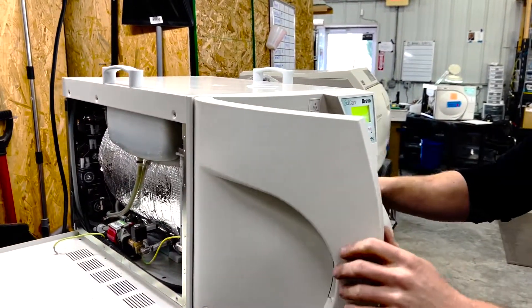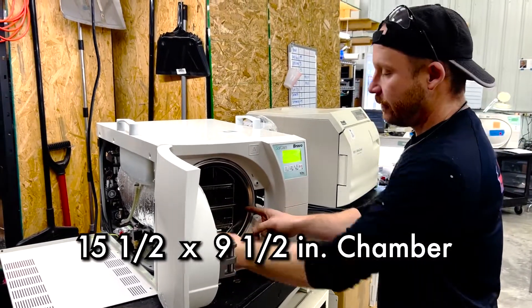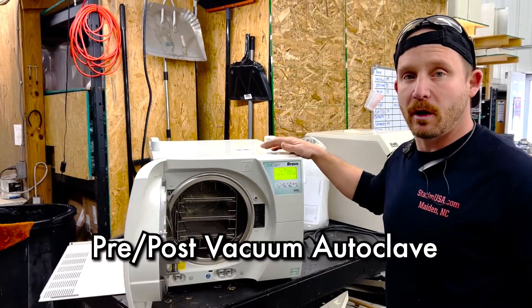This is my tape measure — it's about a 15.5-inch chamber by 9.5. It comes with three trays. This is a pre and post vac unit.